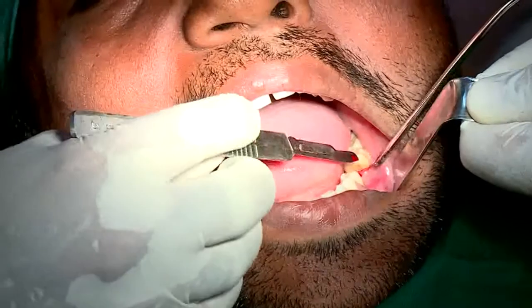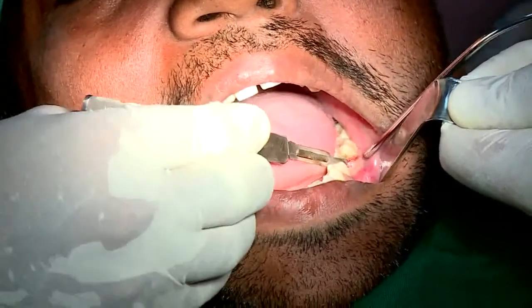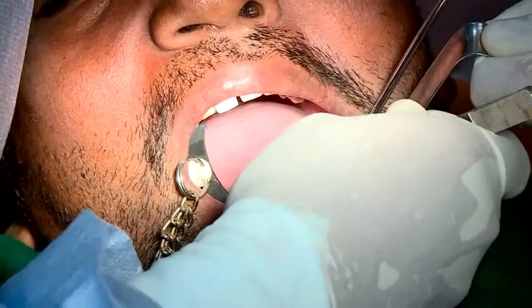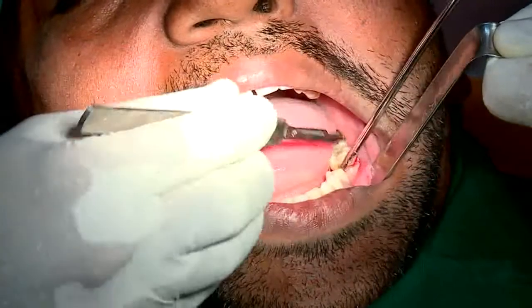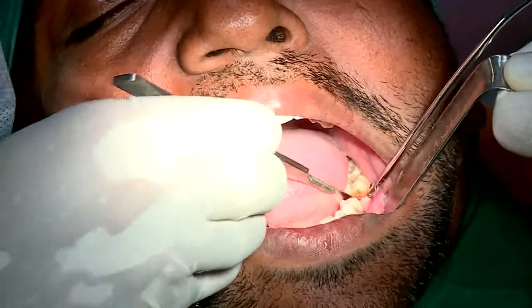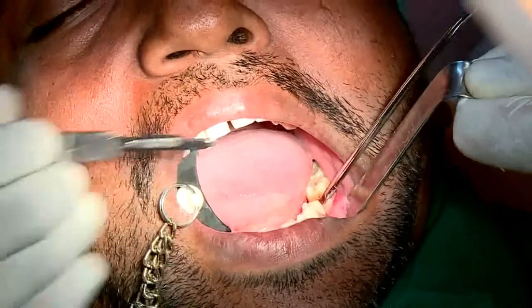What I have done in this particular case is only a crestal incision, so that I can raise both the buccal and lingual sides as if opening a textbook. I don't need to make big relieving incisions at all. We can just open up the flap.